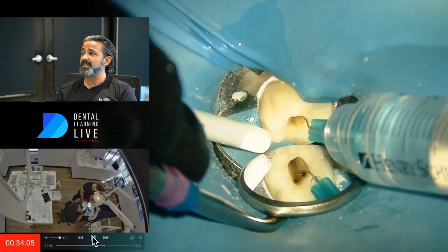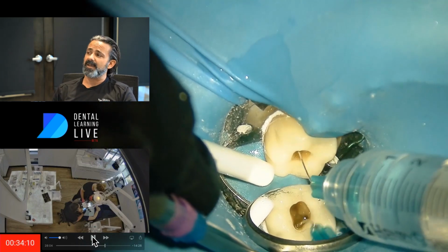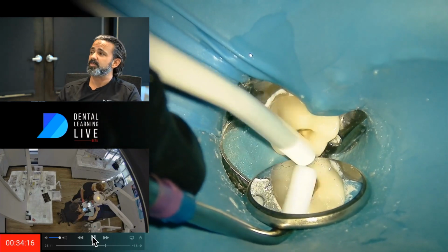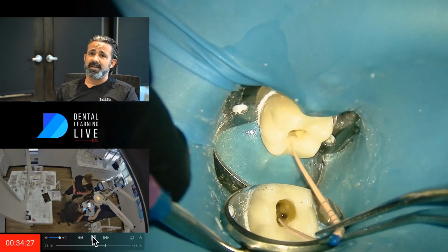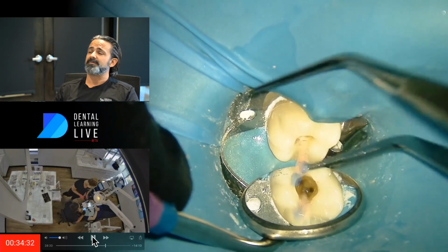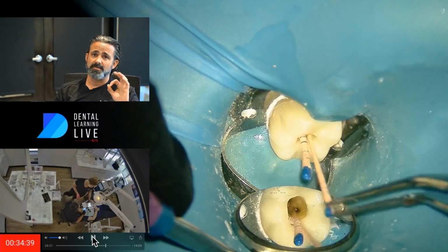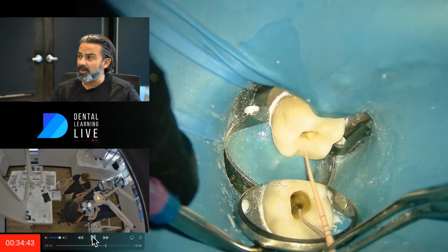So we have patency at some level going on, but not necessarily active bleeding, and the crown margins internally are well set. So I like all that. So it means, okay, we don't have to replace this crown, and I've done my job and didn't over-instrument, and at least I believe at this point the GentleWave has done its job, because I've developed patency by visually relating that to some of the heme that's coming up, just the minimal amount, which is kind of, in retreatment cases, it's usually just minimal like this.